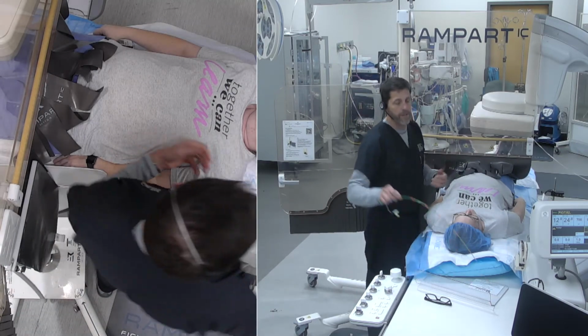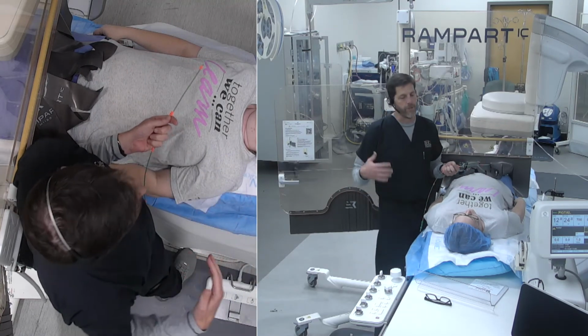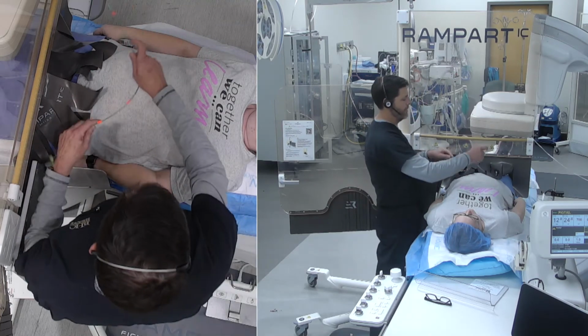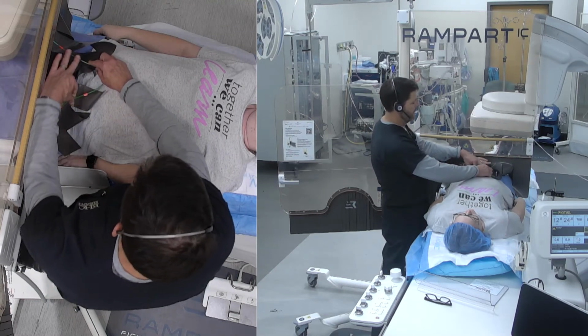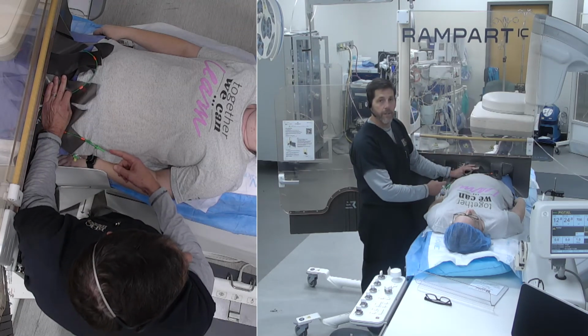Remember, most of the radiation you're going to get is while you're doing the case and not just putting in the sheath. So wearing the lead apron for just a few minutes to get up and over is all you need to do. We already have our sheath in there, and the sheath's going up and over. Then I reach up underneath, grab my sheath, and now I have the access point to my sheath here.